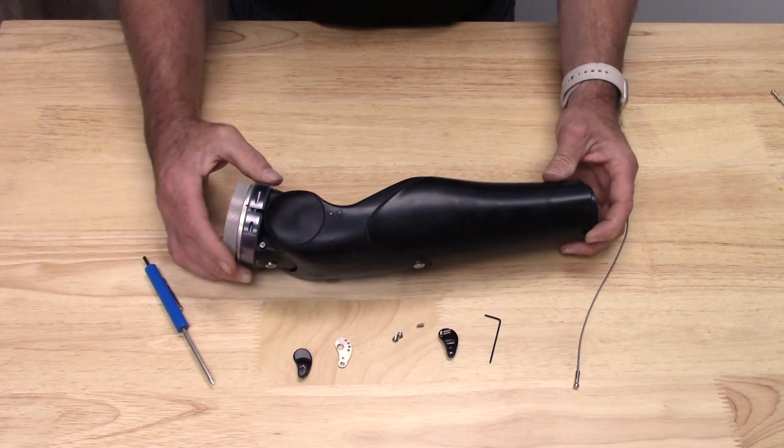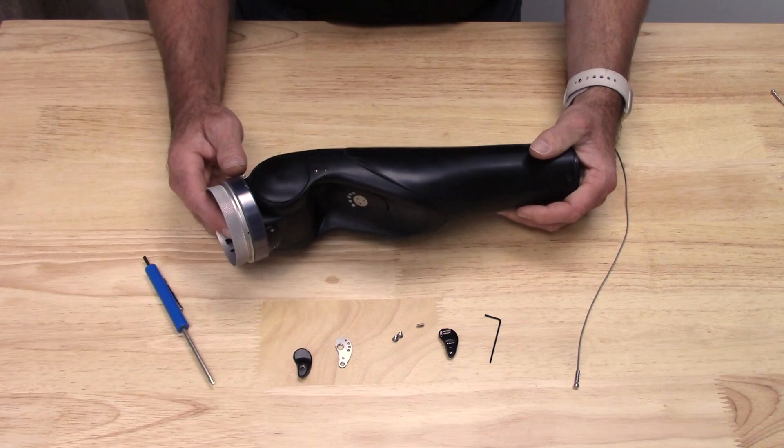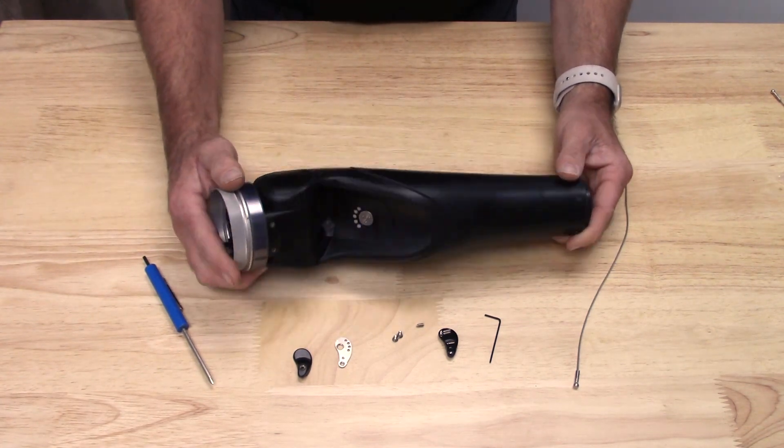If you look at the motion arm, you see two holes on the left, two holes on the right. Today we are going to set this up as a left motion arm.